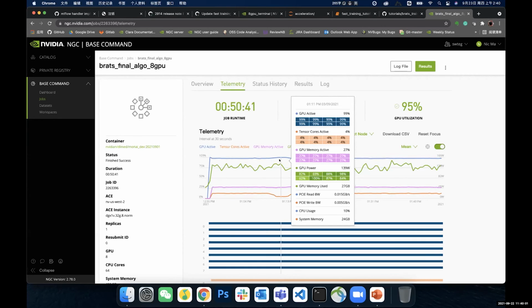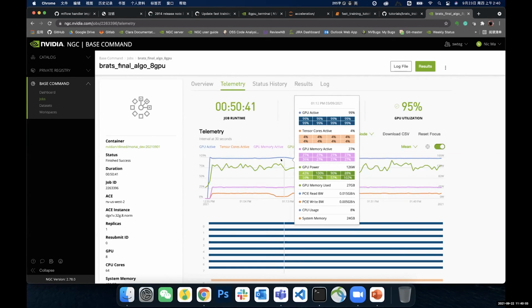You mean the brain tumor example or the spleen example? I think they're trying to see how applicable it is to other data sets, how many data sets you've tested on to see if the performance increases. Okay. Actually, we tried almost all the data sets in the decathlon challenge. There are 10 data sets in that challenge. The spleen, brain tumor.